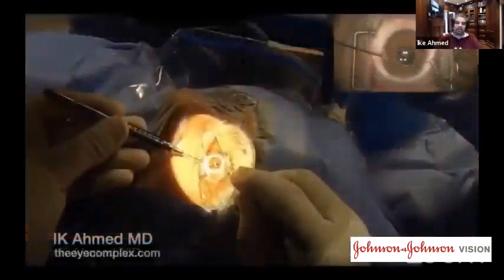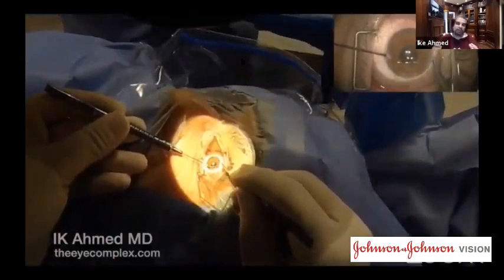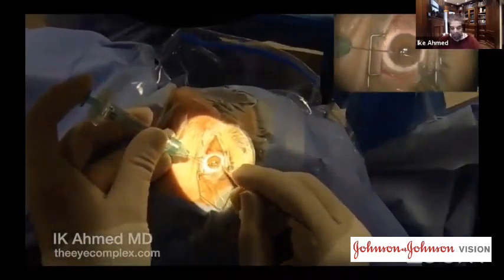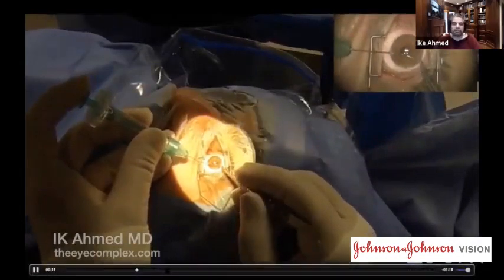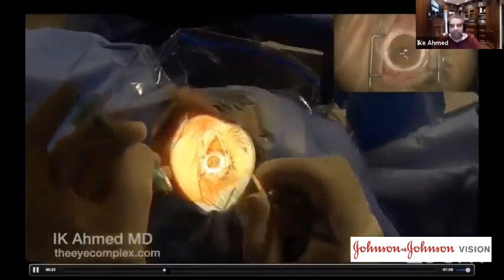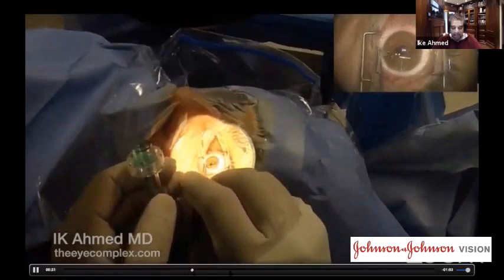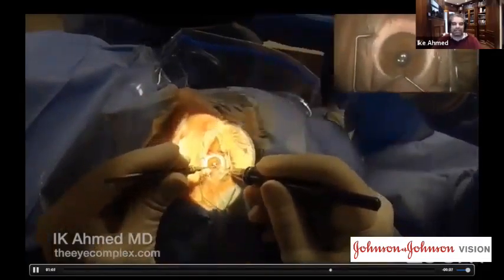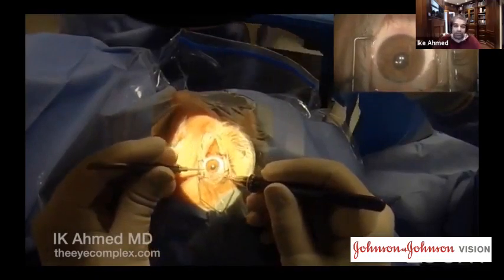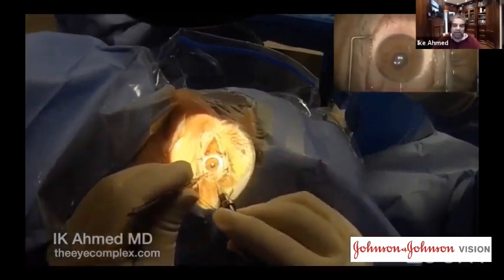But I'll be speaking in English here. I'll be speaking about cerclage. Sometimes what is missed when we talk about iris suturing and pupillary repairs is what our hand positions are doing. The holding and grasping of the instruments, and the twisting and turning and flexing of our fingers really help to ensure that, for example, the needle pass glides freely and avoids traction to the iris. So pay attention. I'm showing this GoPro video just to show the positions of my hands on a patient's eye. When we're tying sutures, you'll see that the instrumentation, in order to place through incisions, should be done in a manner that minimizes torquing of the eye and maximizes the fulcrum ability of that incision. And therefore, holding instruments in a very flat position is advisable, as you see in this video.